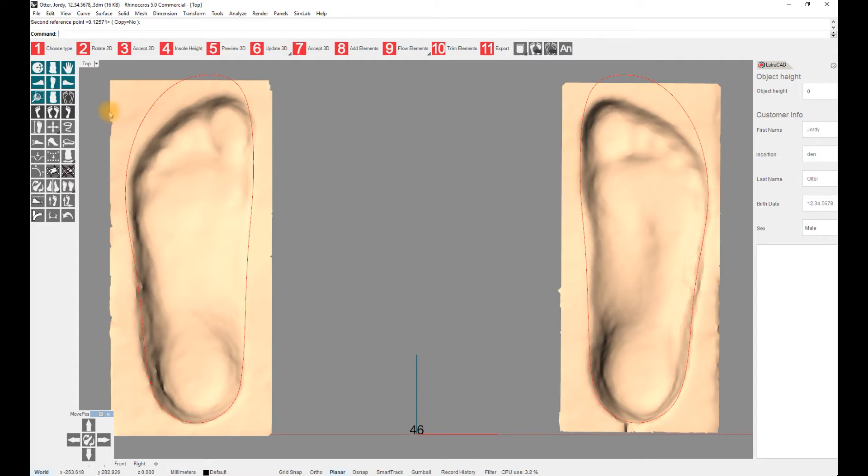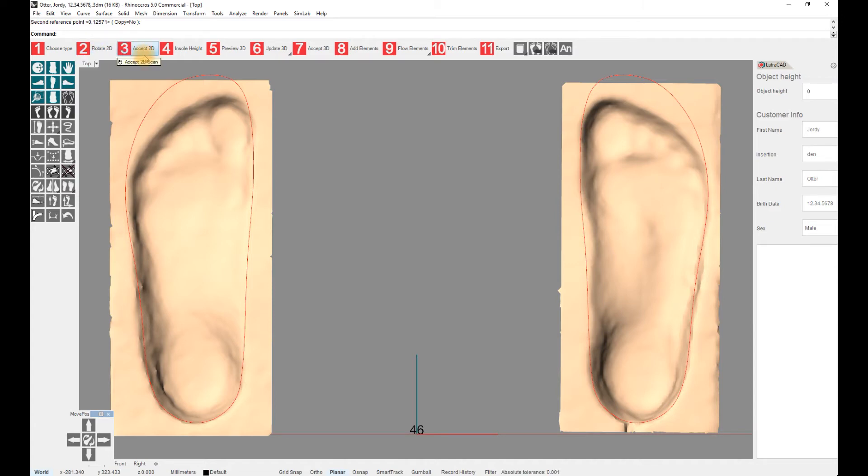At the moment, we do not have any 2D scans for this client, so we can skip step 2, rotate 2D, and step 3, accept 2D, and move directly to step 4, insole height.